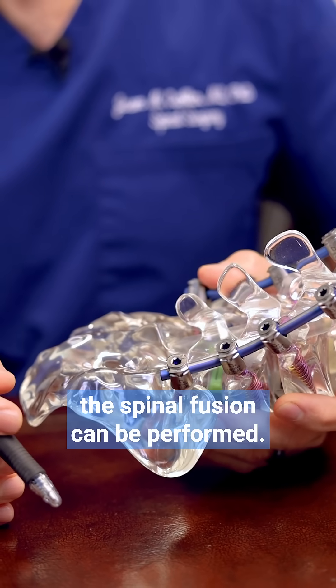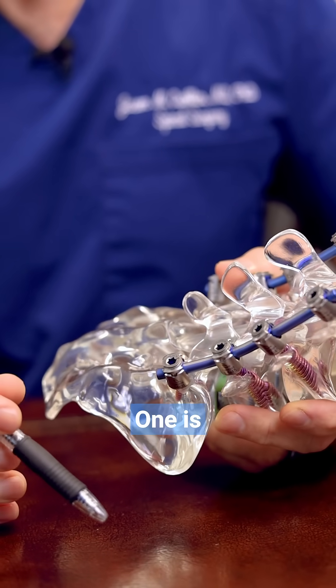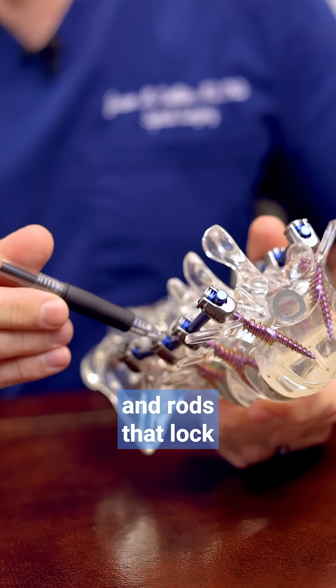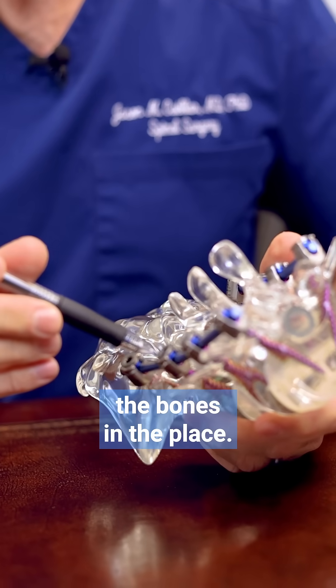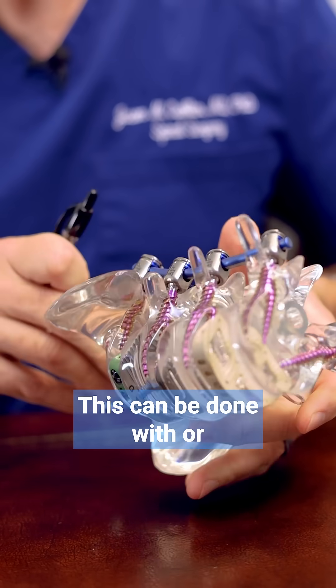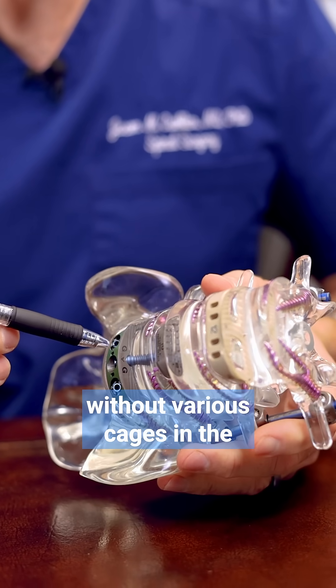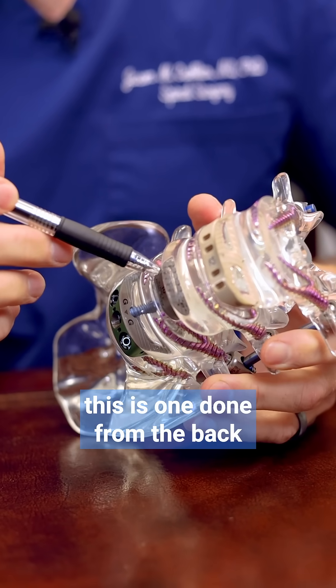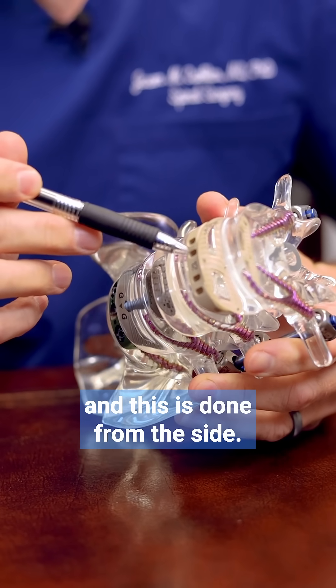There are various ways that a spinal fusion can be performed. One is posteriorly with pedicle screws and rods that lock the bones into place. This can be done with or without various cages in the disc spaces. This is one done from the front, this is one done from the back, and this is one done from the side.